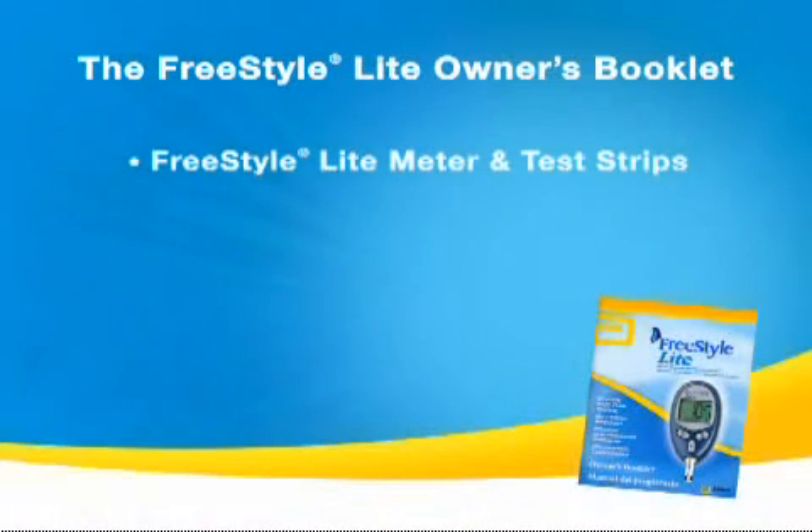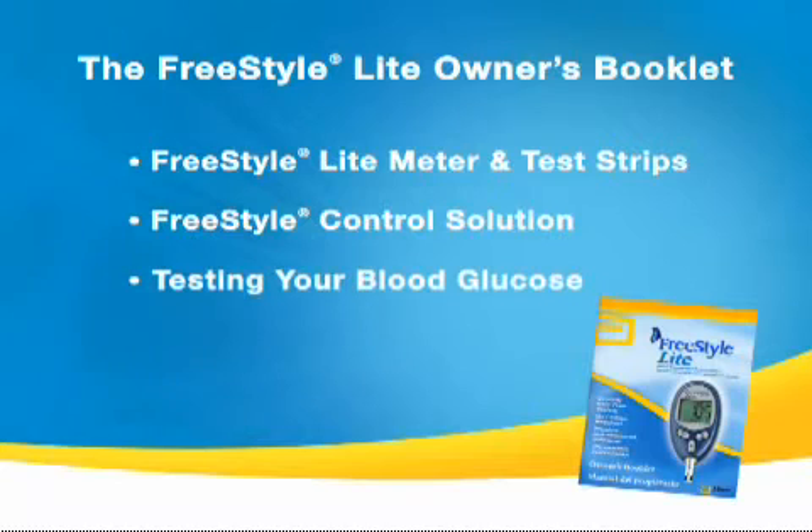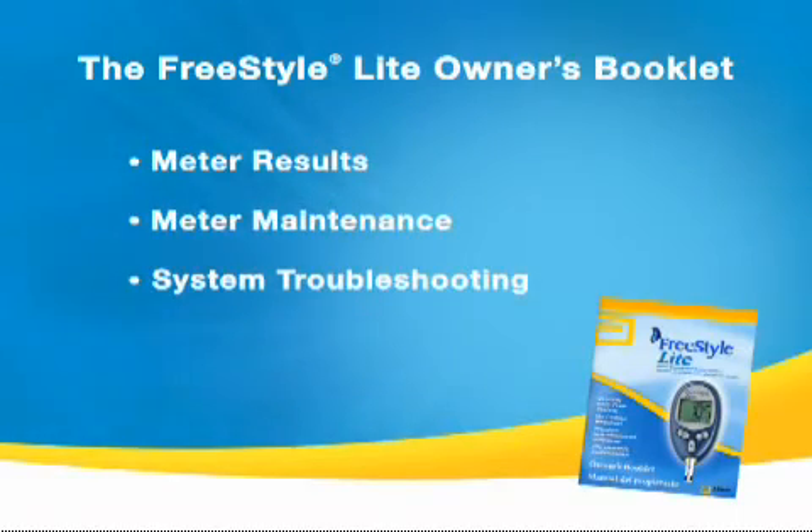In order to follow along, you should place everything you need — the FreeStyle Lancing Device, the test strip vial, and the meter — on a table in front of you. In addition to what we cover in this program, you should also read the FreeStyle Lite Owner's Booklet that comes with your meter. It includes sections on the FreeStyle Lite Meter and Test Strips, FreeStyle Control Solution, Testing Your Blood Glucose, Meter Setup, Meter Results, Meter Maintenance, and System Troubleshooting.